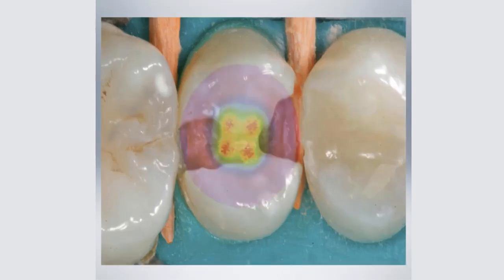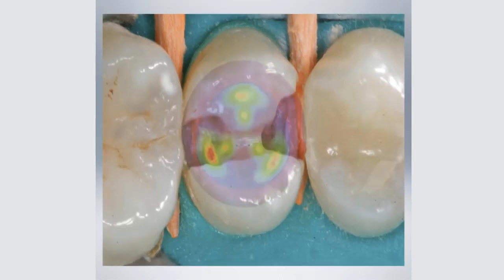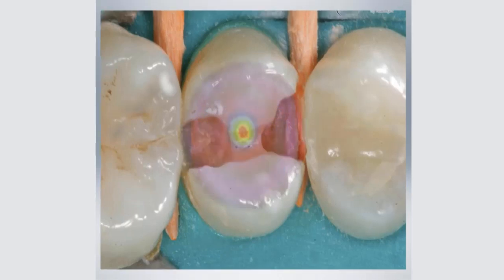How about this top hat? It's still 1,200 milliwatts per centimeter squared, but the deepest part of your restoration is not even being addressed here. So I would be very leery of this. Now remember, the light is all blue. You won't know about the effectiveness of this light at all. But when we map it out, it's a very suspicious light. How about this? Even worse, right? Because you've got a very erratic pattern of effectiveness here. This is even worse, right? I'm going to be very leery of curing anything in these areas.